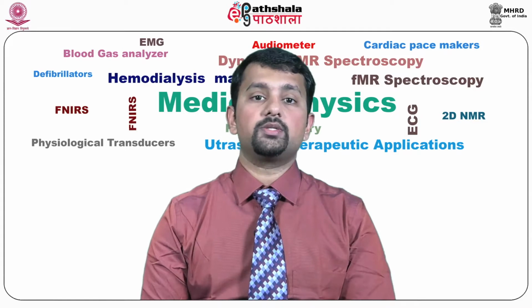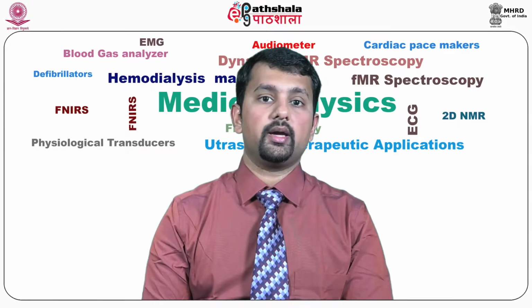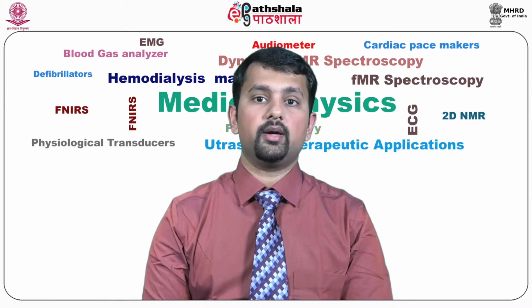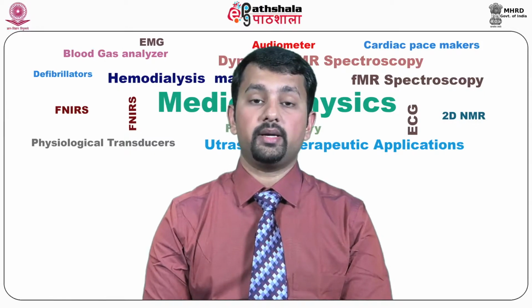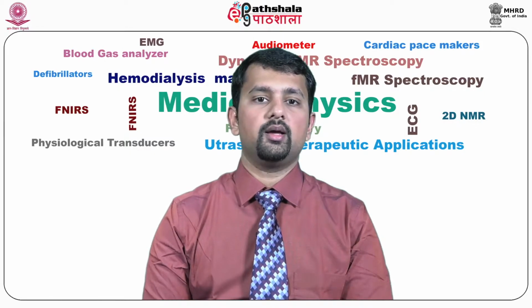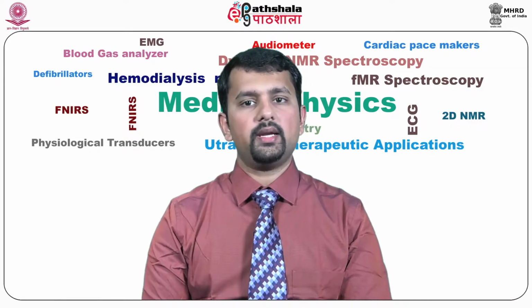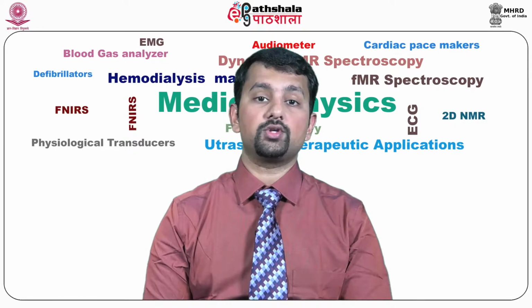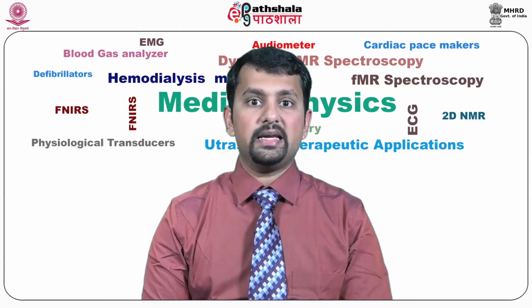Other metabolites observed in brain neoplasms include taurine in primitive neuroectodermal tumors, alanine in meningiomas, and glycine in high-grade pediatric tumors. If biopsy is required for diagnosis, the choline NAA ratio can help us differentiate areas of solid tumors with the highest cellular density from edema.